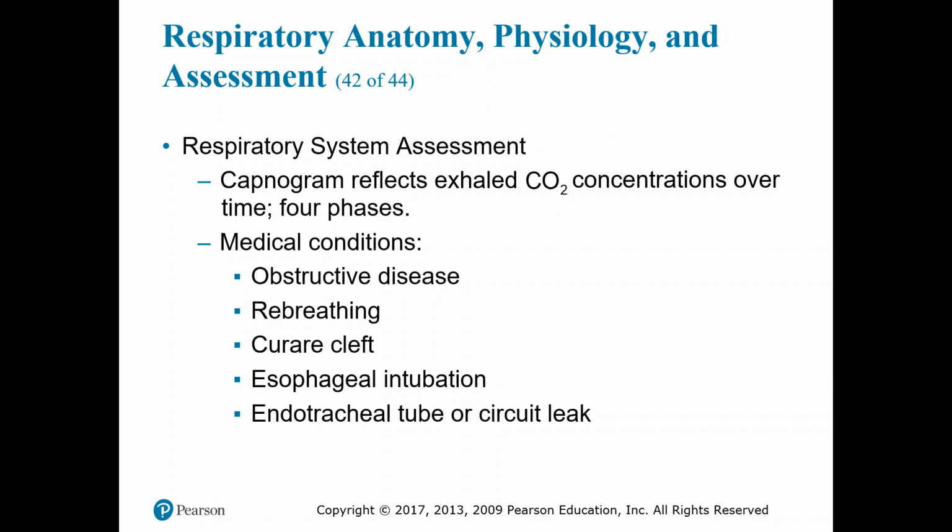And 3 is where it levels out. It's called the respiratory plateau, and it shows the airflow through uniformly ventilated alveoli with a nearly constant CO2 level. The highest level of the plateau is called the end-tidal CO2 and is recorded as such by the capnometer. So you're going to have an upswing, and then it plateaus, and then at the end of that plateau is your end-tidal CO2, and that is where your number is taken from.